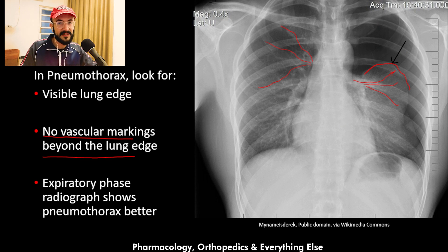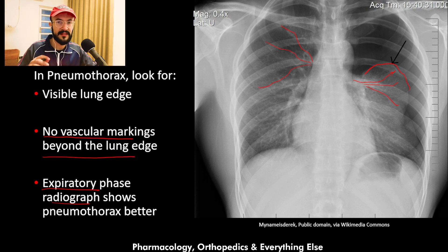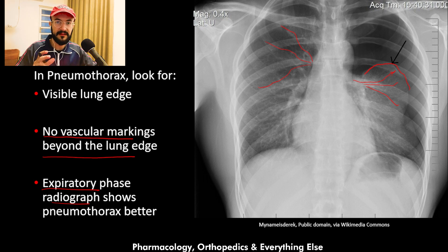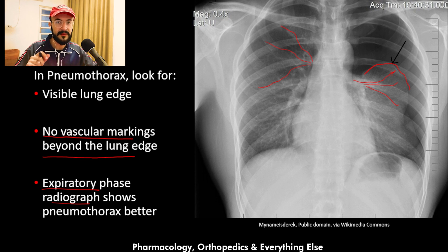Pneumothorax is best viewed on expiratory phase radiographs. X-rays taken during expiration are better for viewing pneumothorax because the lung is smaller in size, making it easier to see the lung edge and the pneumothorax.